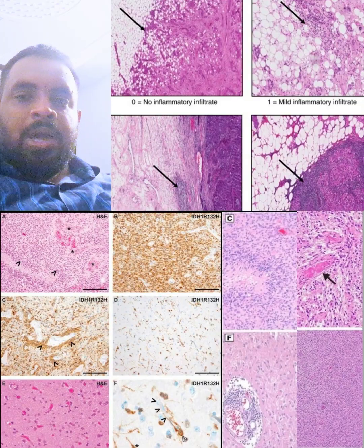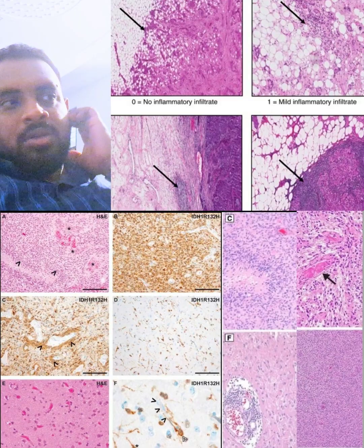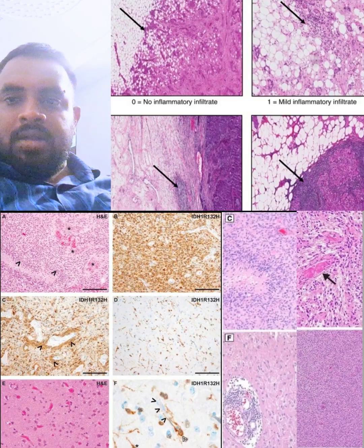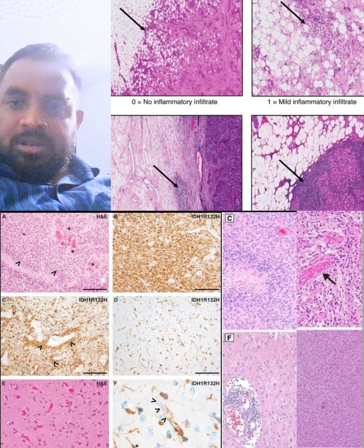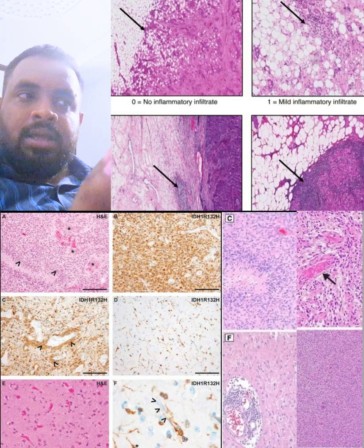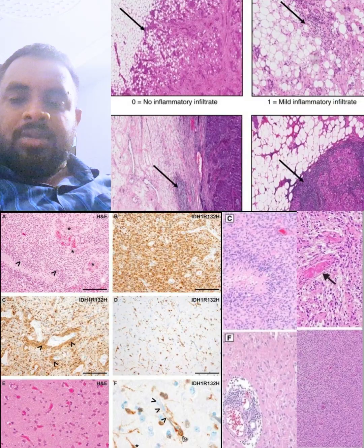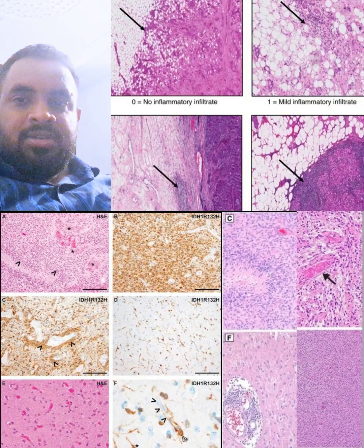By the time the differential leukocytes increase, you can see different structural changes in the tissues. If you see any deviation from the normal structure of the tissues, then these lesions have those characteristics.